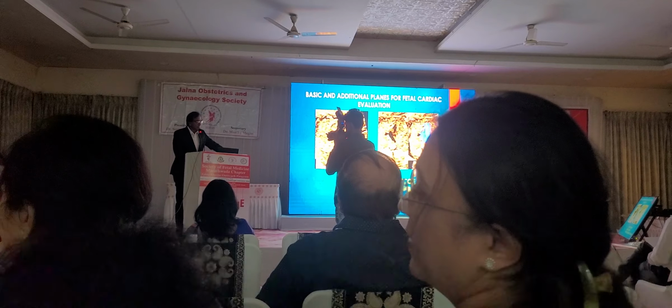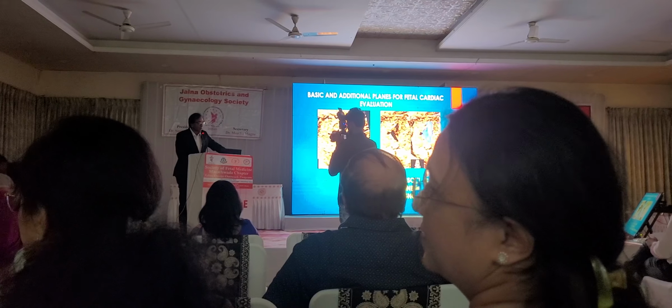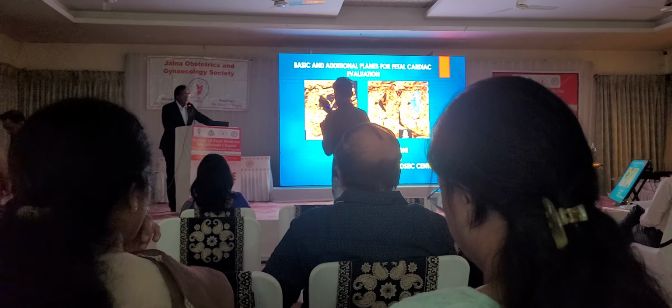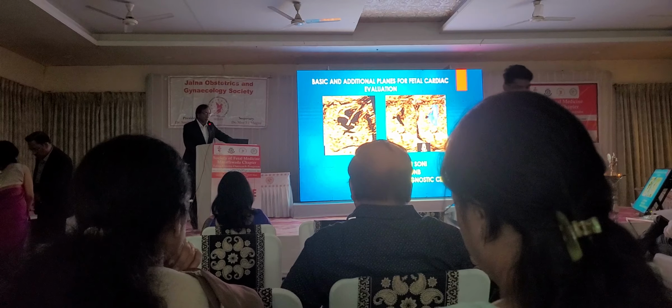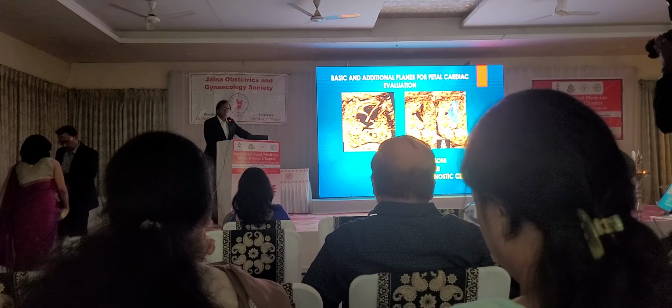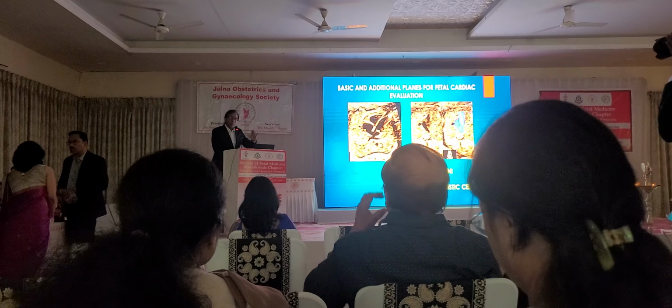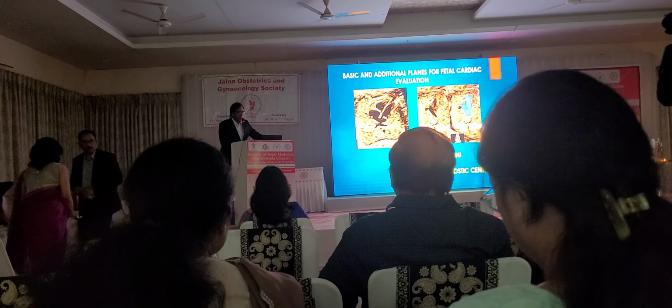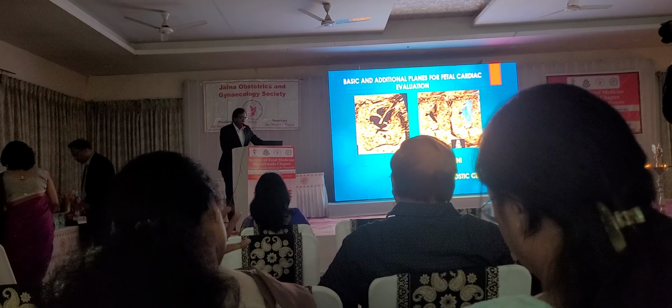So the topic is basic and additional planes for fetal cardiac evaluation. If we finish all this, we'll see some normal variants, and in the end, we'll see some cases of abnormal cases with normal four-chamber view, because abnormal four-chamber view will be dealt with in the next talk by my friend Dr. Vishnu.